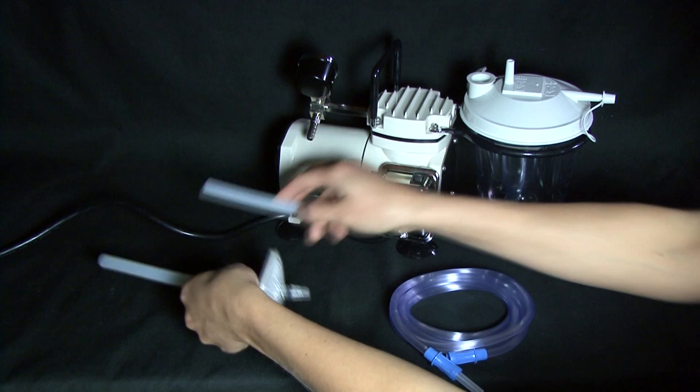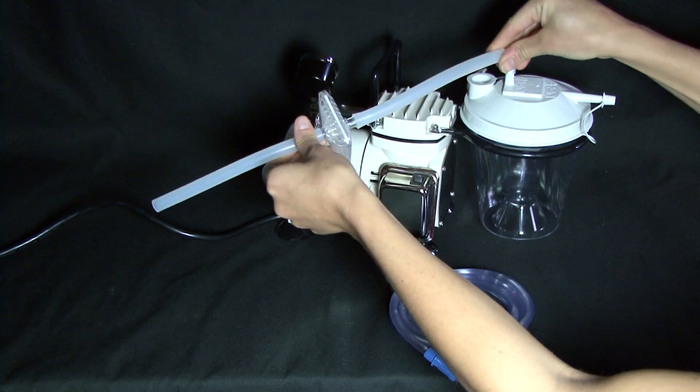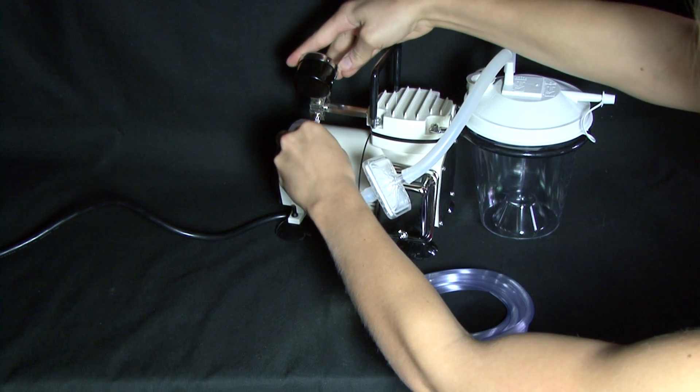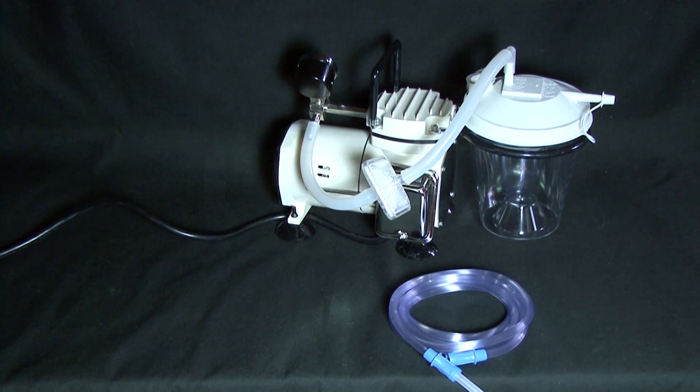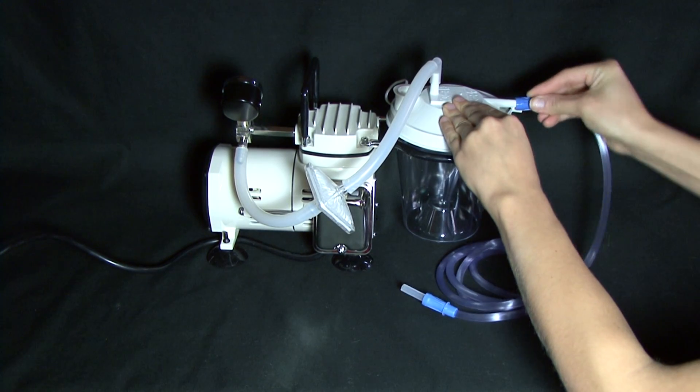Connect the two tubes of the tubing filter together, then connect the straight end to the air inlet of the pump and the right angle end to the air outlet of the canister lid. Next, connect the suction tube to the fluid inlet of the canister lid.